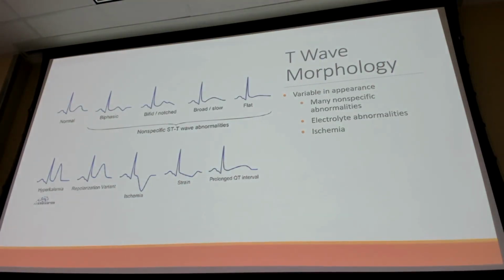All right. And then our T-wave morphology can look like anything, really. So they can be kind of difficult. You might have a biphasic T-wave, and that whole top block up there after the normal is what we just call nonspecific ST and T-wave abnormalities, which we see very commonly. It isn't indicative of any specific pathology, but sometimes depending on the morphology on the bottom.